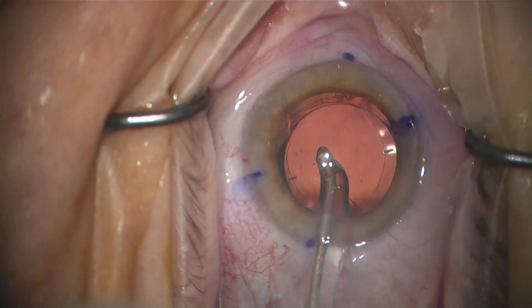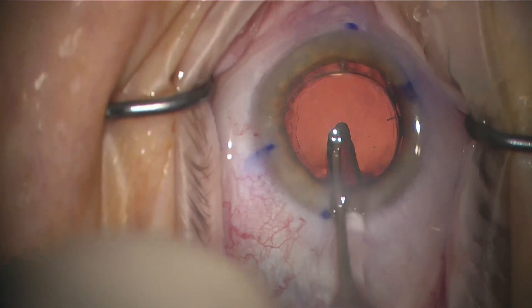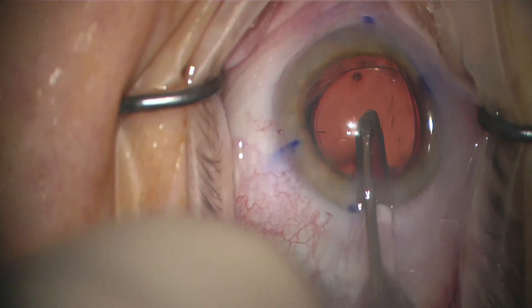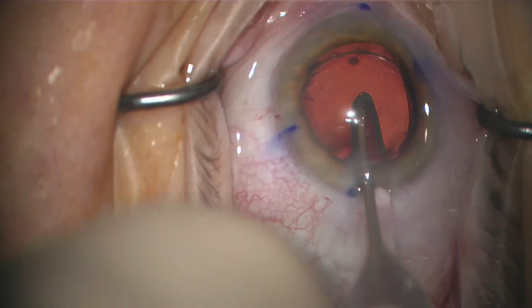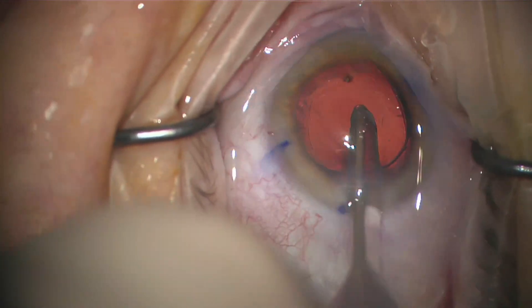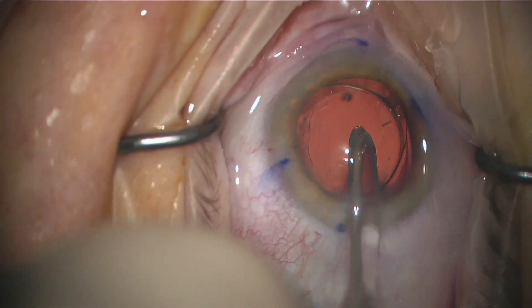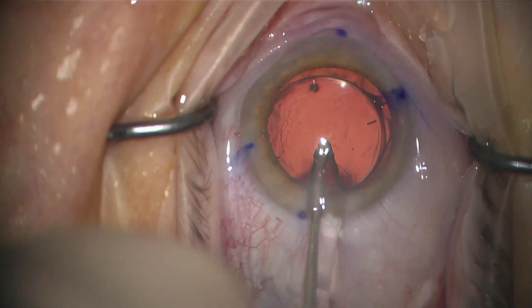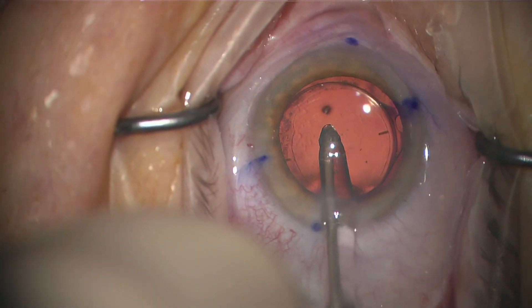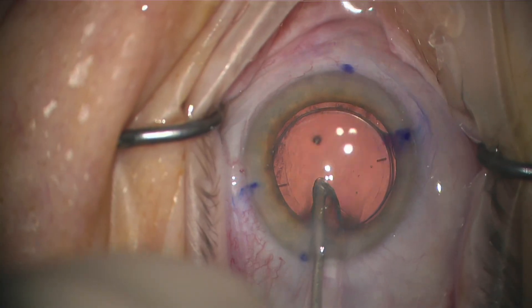I'm suctioning down on the lens with my irrigation aspiration — this happens to be an MST tip called the Allegro, with a little curve on it. You're suctioning down or aspirating down onto the lens with the opening of the tip on the lens to rotate it exactly where you need it. This is great, especially when the lens is rotated a little bit past the markers where you need it.